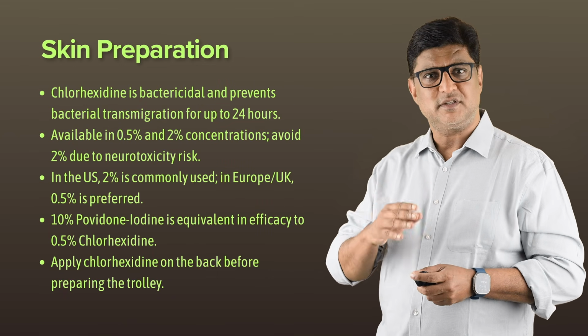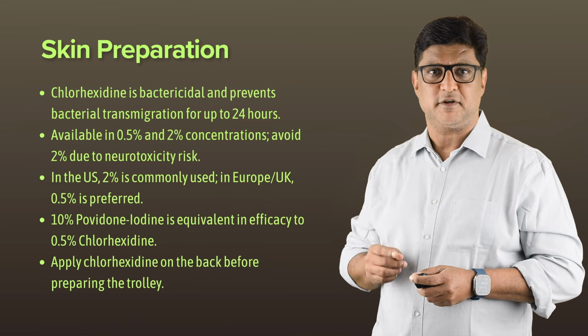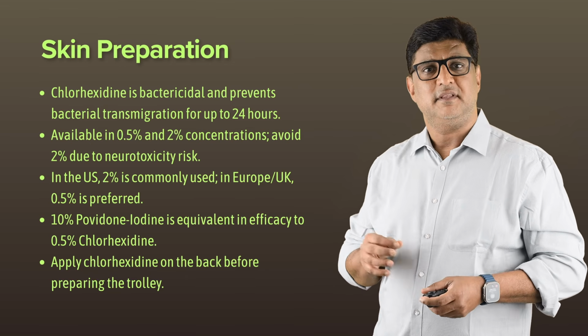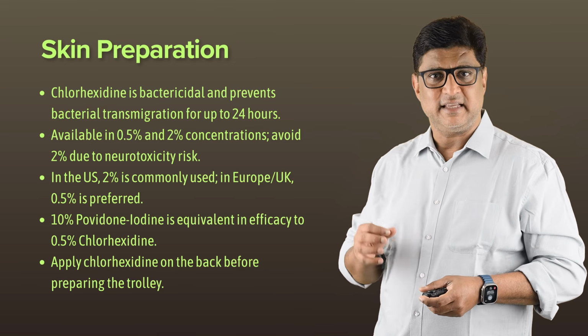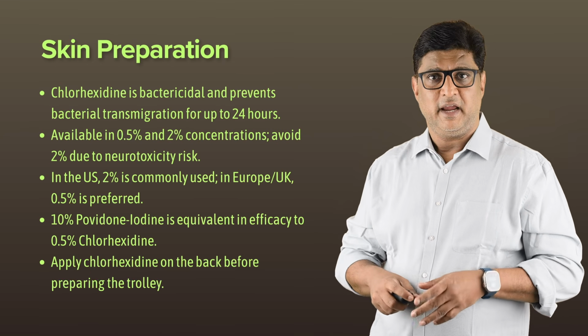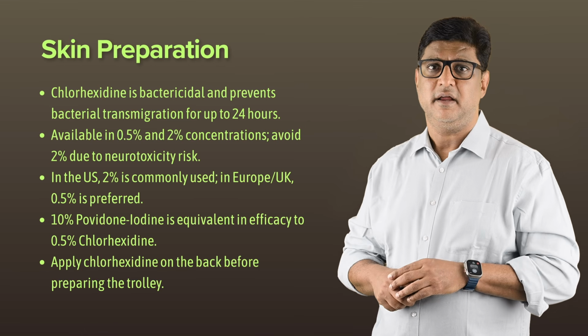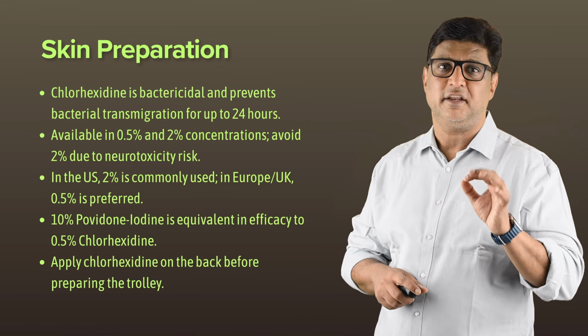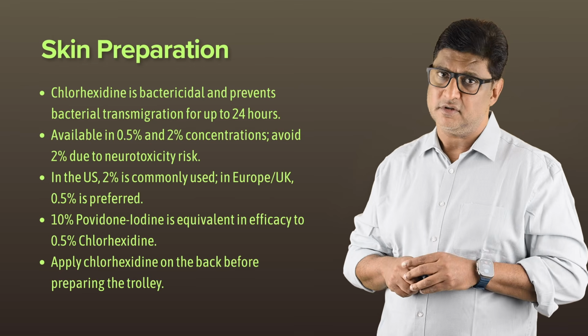So let's move step by step, starting from the skin preparation all the way to the different techniques. We begin with the skin preparation. Chlorhexidine is the agent of choice when it comes to skin preparation. It is bactericidal and prevents the transmigration of bacteria for up to 24 hours after use.